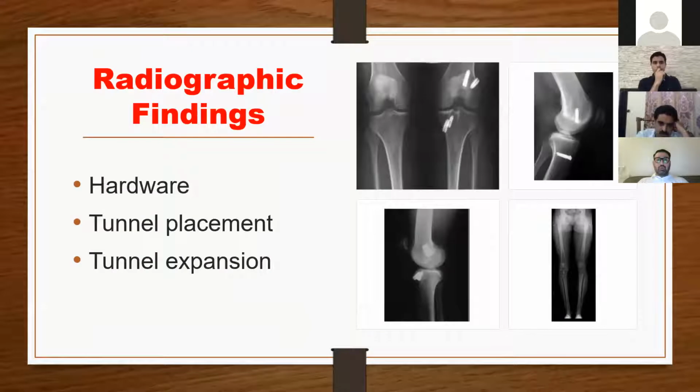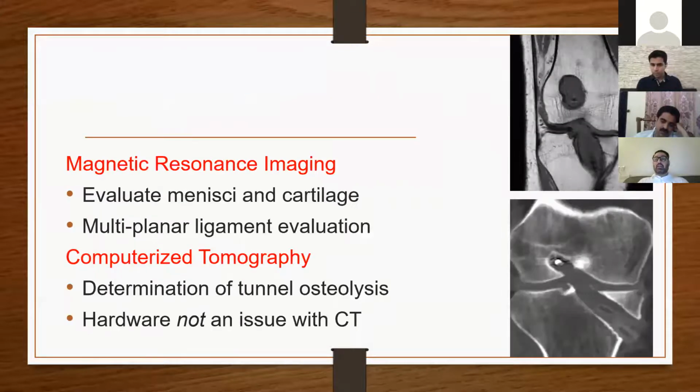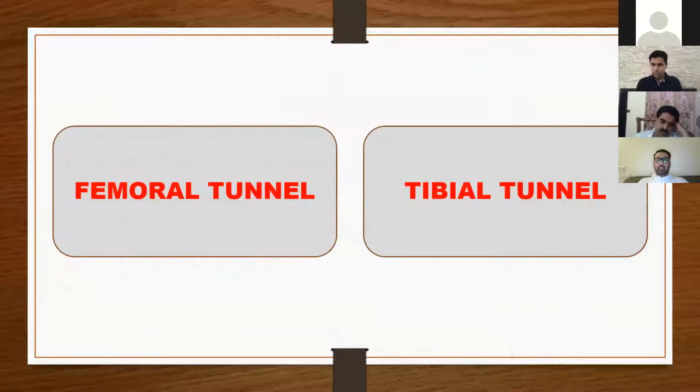Radiograph is important to look at the metallic screw positioning or any loose body. And I always like to do a long leg alignment view in a patient in whom I'm performing revision cases. MRI scan and CT scan will give us much more insight into cartilage and meniscal tear, and also osteolysis if you use CT scan.